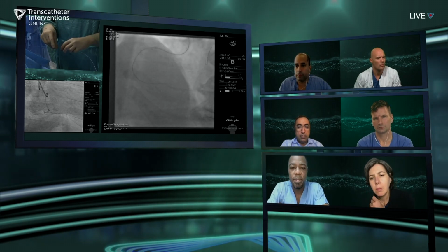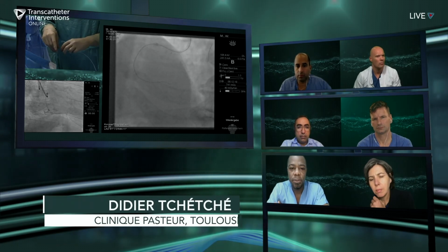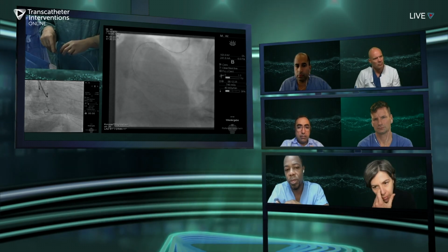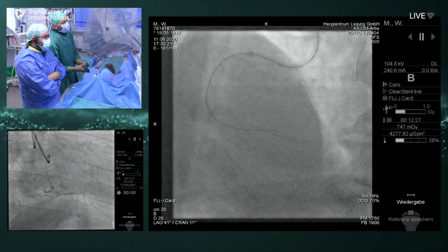I think it totally makes sense to start to work a little bit on the retrograde side and to see the progress that you make, because it's a good thing that they went subintimal. If they can navigate retrograde and connect just at the proximal end of the distal RCA, it's going to be a good location from my side.